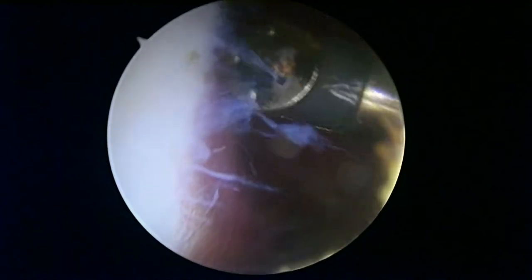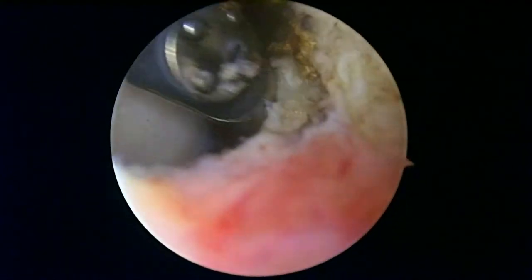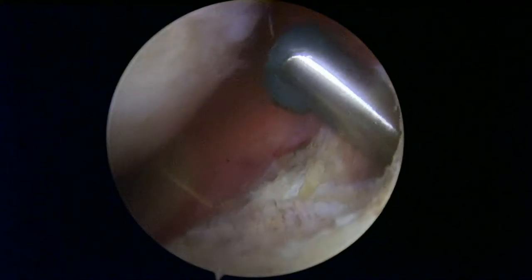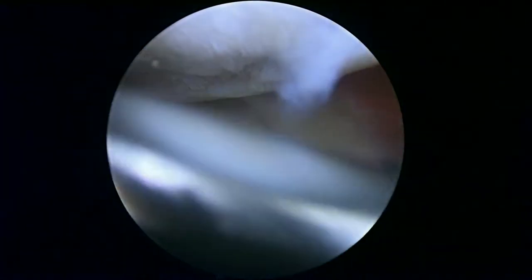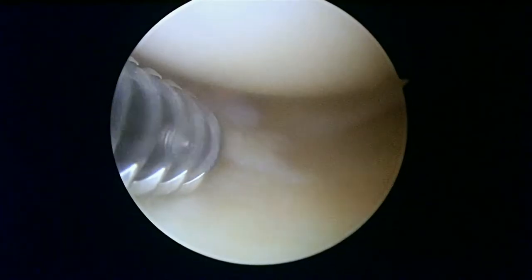We're just about done on the right knee. We've tried to get things under control with the bleeding from the vascularity, and back down to the front of the knee — that's looking a lot better. We're going to be finishing up here and getting you back to the recovery room shortly after we get the left knee sorted out. Now we're looking in the left knee — this is the medial compartment of the left knee.